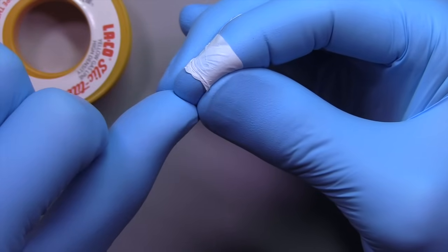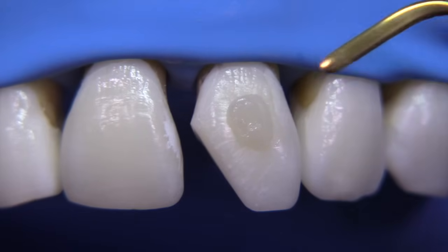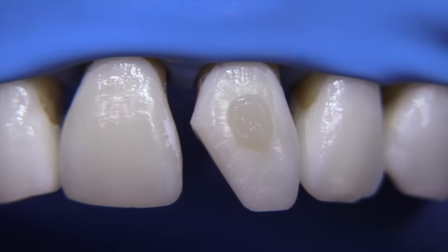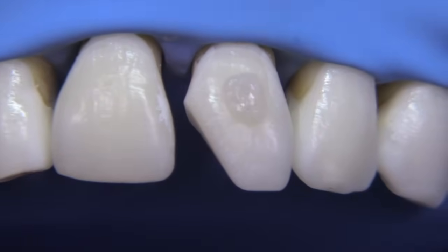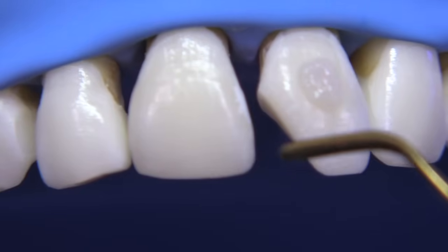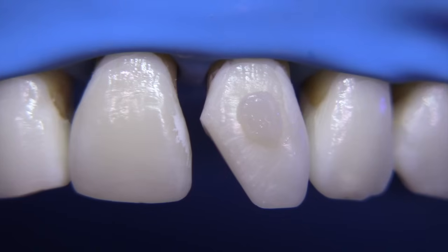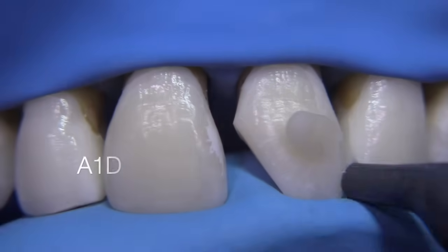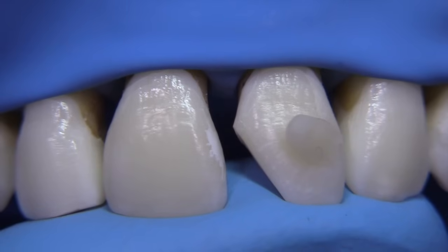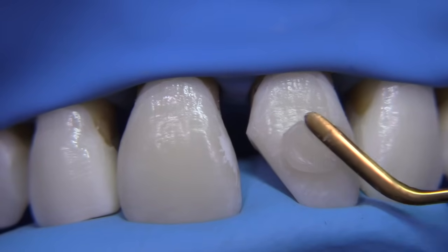Let's test the shades. I don't always do this because once the rubber dam is on, the tooth is drying out, so it becomes a little irrelevant what shade you choose by trying it this way. It's usually better to just pick your shade and go with what you see. Hybrid composites when you cure them always shift in their value — they're never going to be the same value coming out of the tube — so when you lay it down you might think it's the wrong shade, and then after light curing you find a completely different situation.